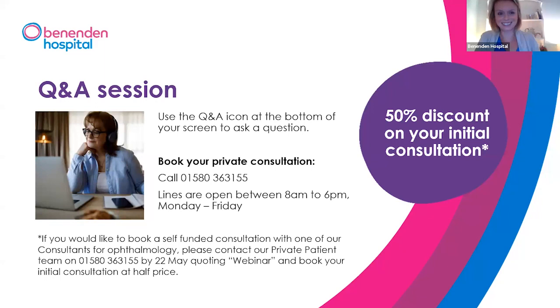I prefer the halogens of today. It's funny you mentioned that, there's actually an option on the operating microscope to turn the very state-of-the-art microscope into a halogen effect light. I've looked at both of them. One of them is horrific bright blue, so I always turn it down into the slightly softer candle light of the halogen. But yeah, the glare is normally a sign that your cataracts are getting on, and that's a reasonable thing.